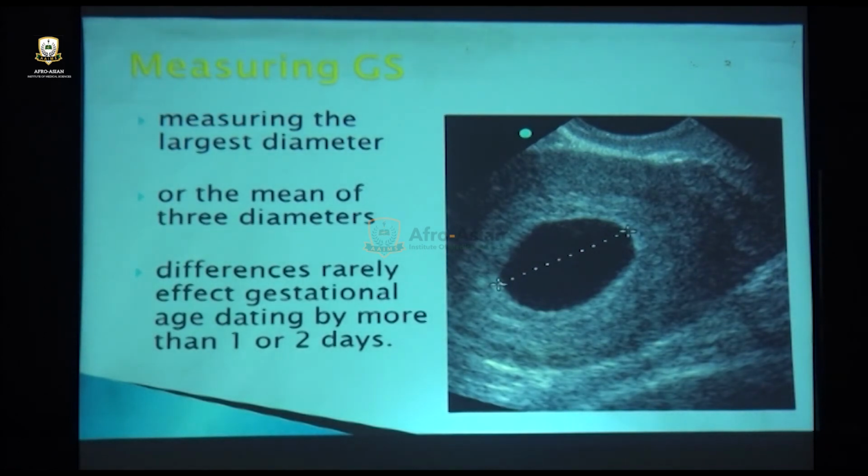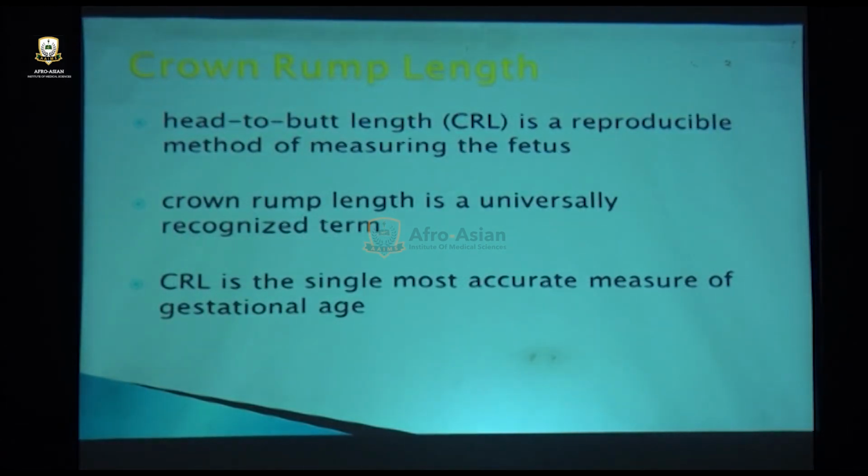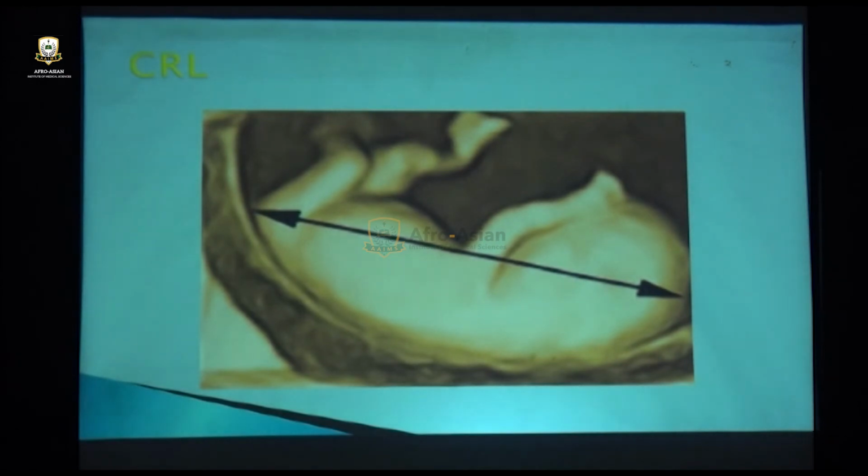Measuring gestation. अच्छा, इसी में फर्स्ट ट्राइमेस्टर में आपने उसकी डिटर्मिनेशन एज की भी करनी है. तो जेस्टेशन सैक का मीन जो डायमीटर है, मशीन आपको बता देती है कि इसका कितना साइज है और कितनी इसकी एज है. Then there is the crown rump length. This is a little more precise. Do measure the crown rump length, and that gives you accurate age.